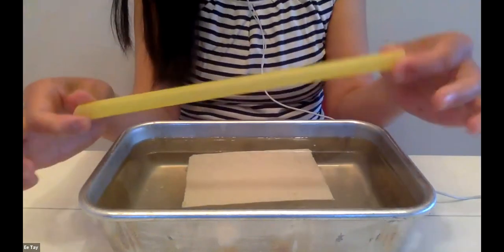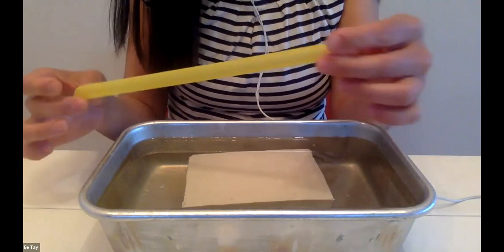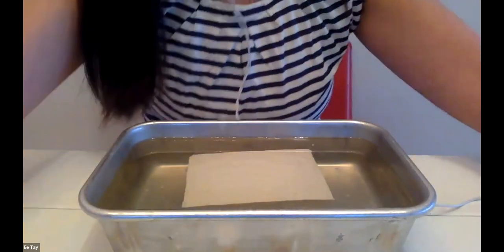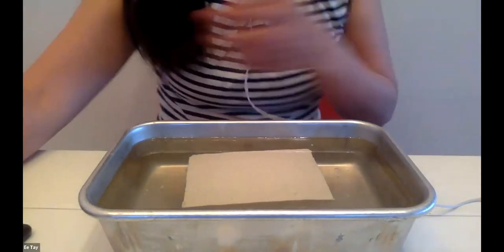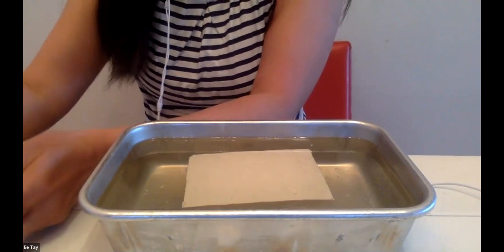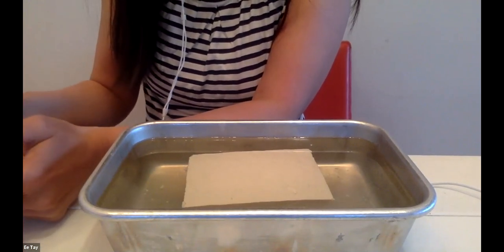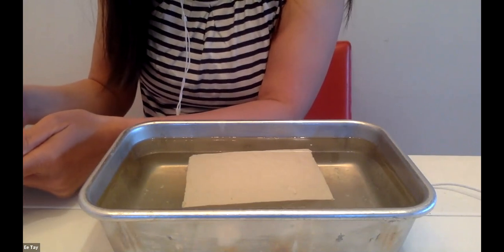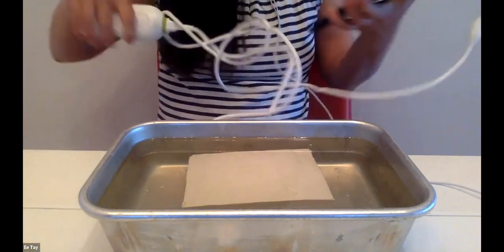Okay, all right, so here's my tofu. And then what I did was, here's my, I went downstairs and got a bubble tea straw, and I stuck it in there because I didn't want to do the Penrose thing again because that was really hard. And then we're going to see if this actually works for you. So I have my handy Lumify.